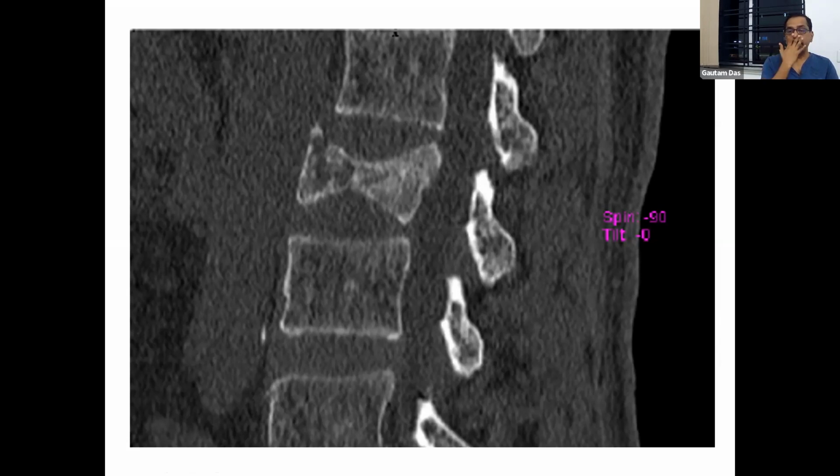And how can we identify the bony part? By a CT scan. So ideally, particularly after major spine trauma, we need both a CT scan and an MRI. The CT scan gives a good outline of the bone, while the nerves and soft tissues are best identified by MRI. But if we cannot have both, at least an MRI.